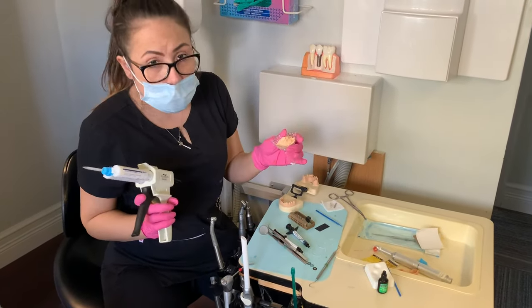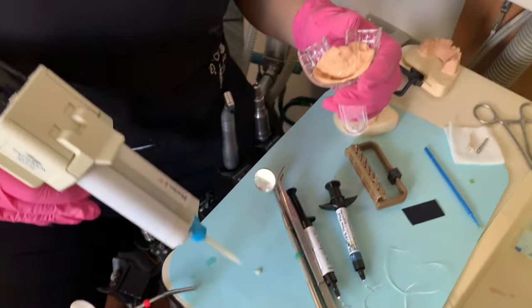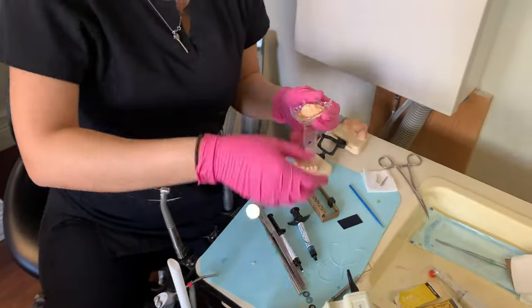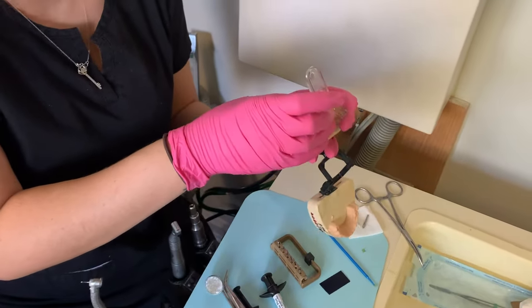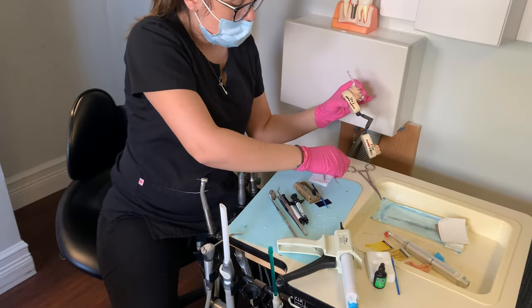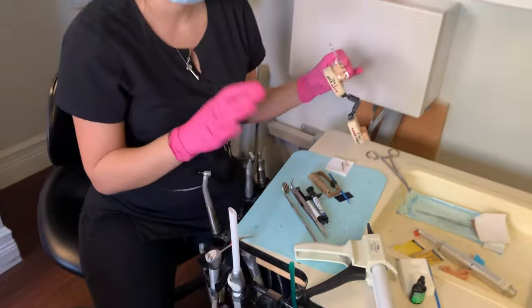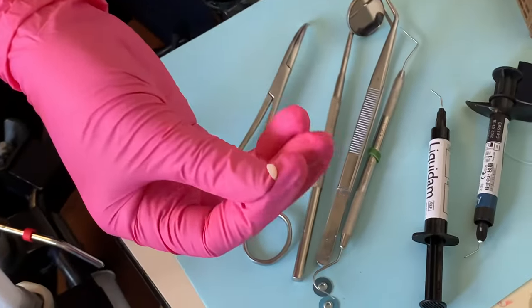Now you're ready to make your temporary — make sure you choose the right tooth. You're going to put a little bit of your material on your paper or your tray so you know when it's ready. You're going to go into your tooth and fill it in. Make sure you don't fill it in too much — that should be enough. Put it in and hold it in your patient's mouth. This piece on the side is going to help you know when it's ready. Some assistants like to know the setting time of every material, but I just know when it's ready when I touch it and I can pick up the little temporary piece. That means it's ready.